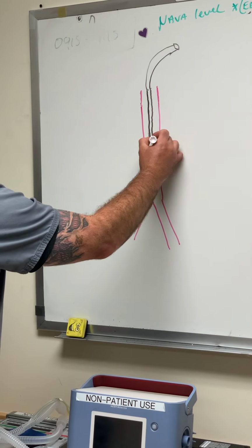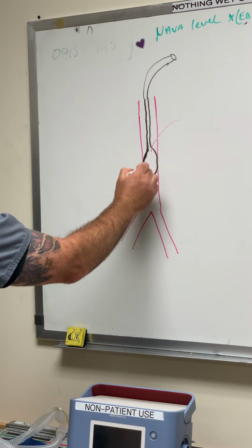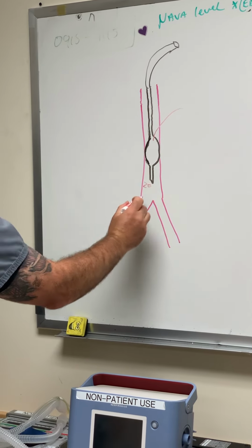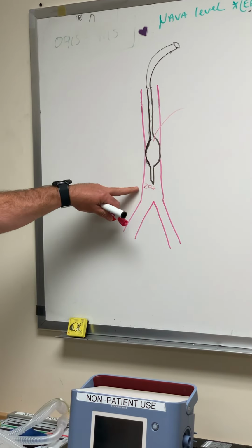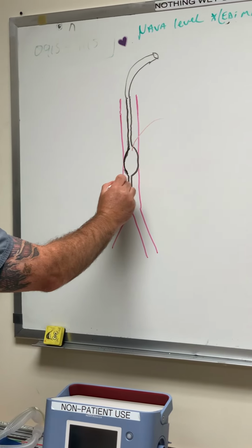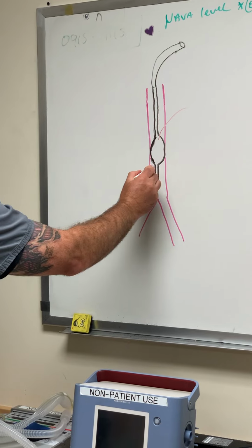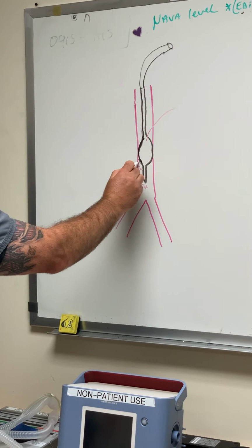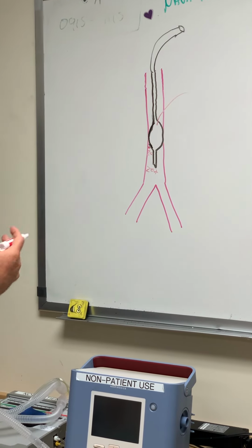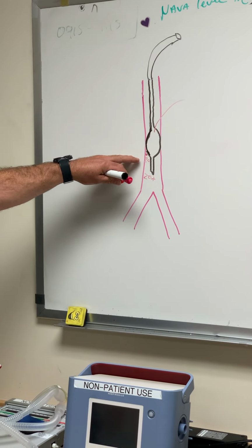And what that means is you have this pilot balloon coming off of this cuff, and we're going to add air or liquid in this cuff so that the pressure that we're trying to ventilate at, let's say it's positive 20 of pressure coming out below the airway, means, based on our zero flow I-time policy, that 20 of pressure is going to be below this cuff right here at some point at the end of inspiration, for sure. By the end of inspiration, 20 of pressure is going to be realized below that cuff right there.